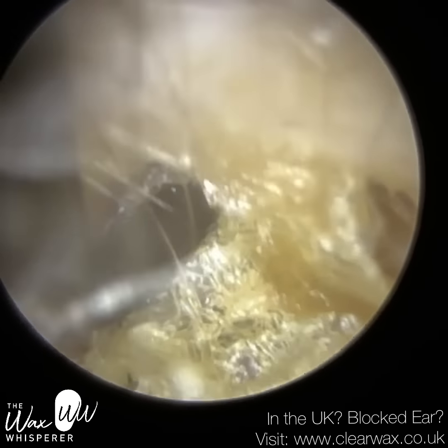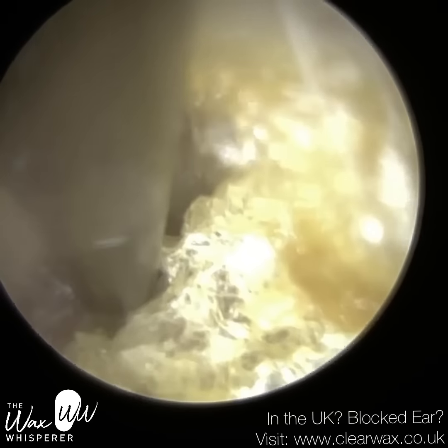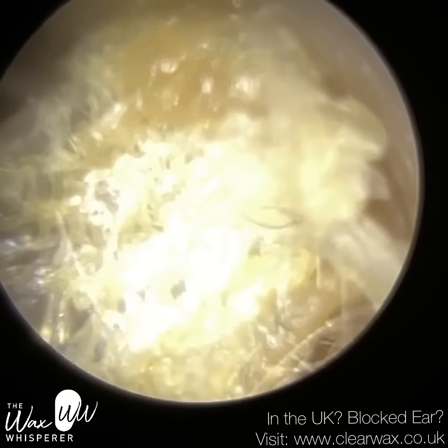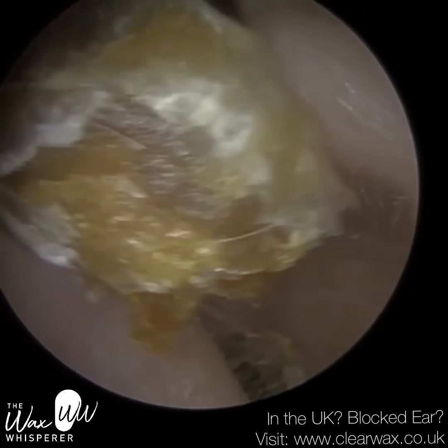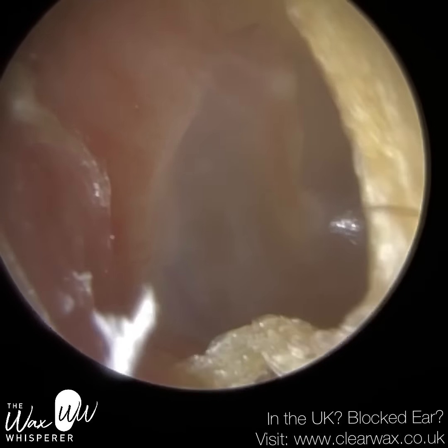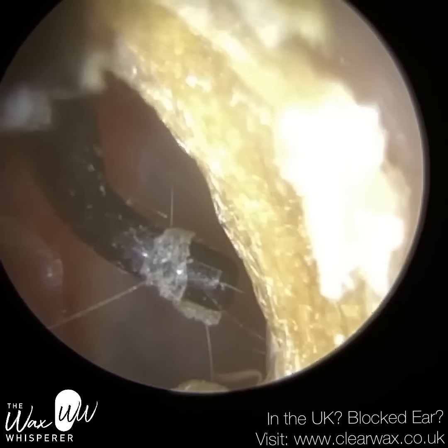And here they've got this plug of skin and wax, but it's enveloped and shielded by this thick layer of skin. As you can see, I just had to maneuver that out of the way, which then allowed me to insert the hook beyond the skin and wax plug. And similarly to the left ear, I rotated the hook before slowly leveraging out the plug.